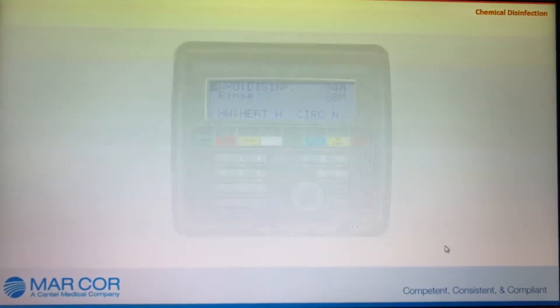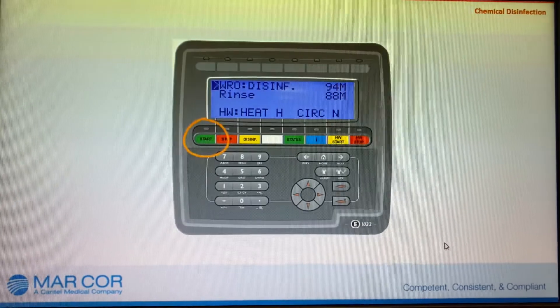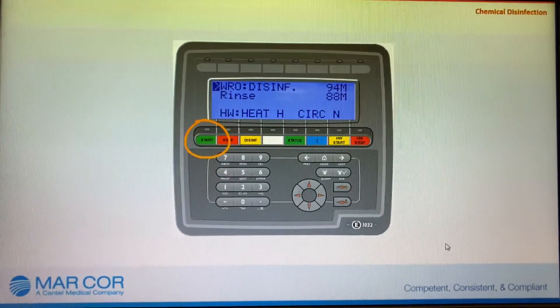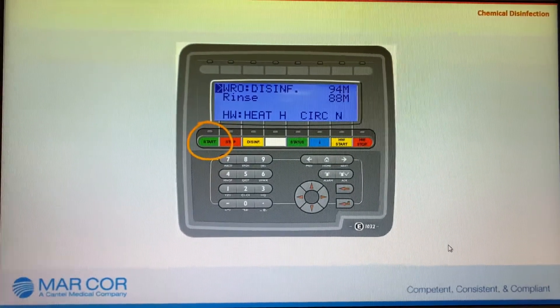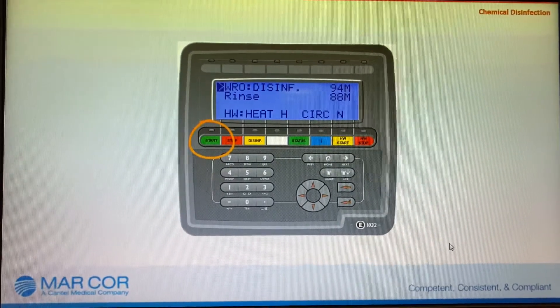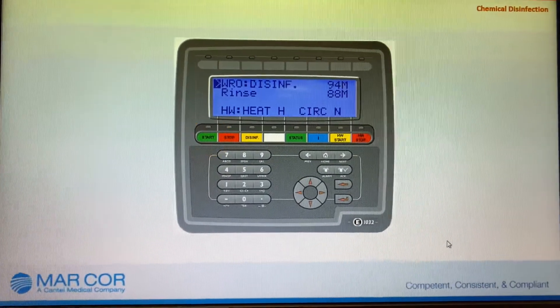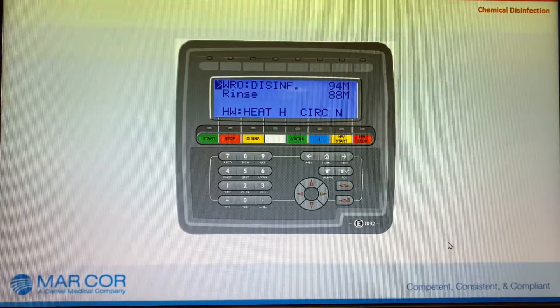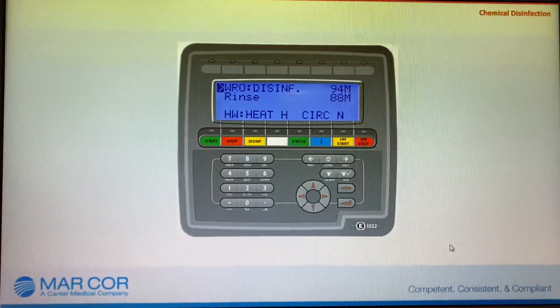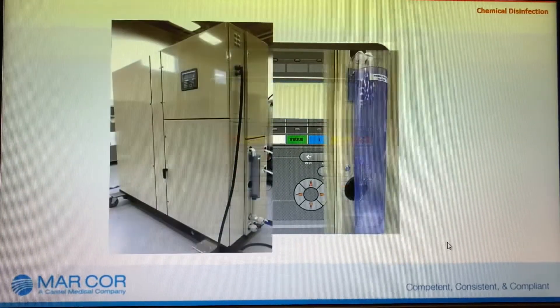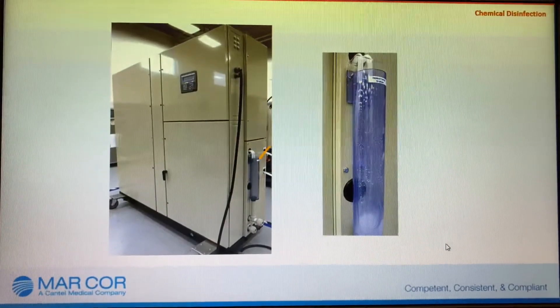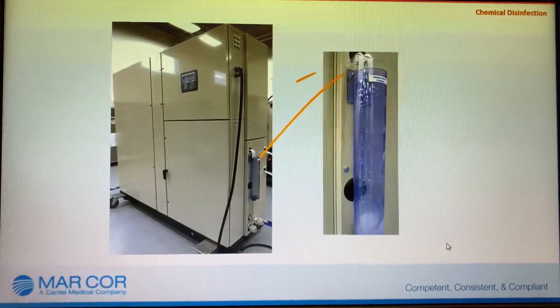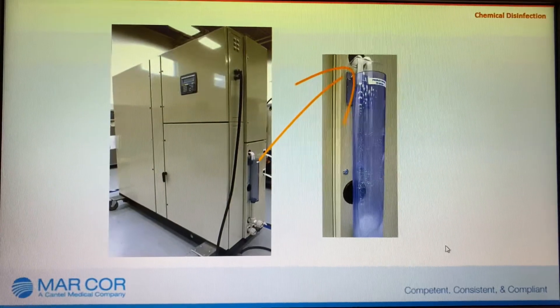Press start. Pressing start initiates a flush to drain. After approximately one minute, collect a water sample in the drain funnel on the right side of the CWP and test for residual disinfectant.